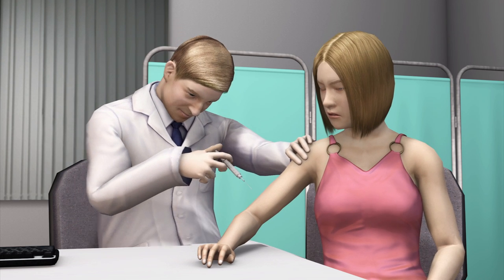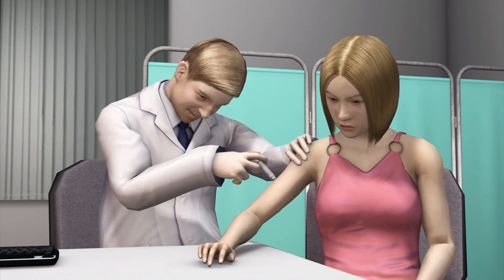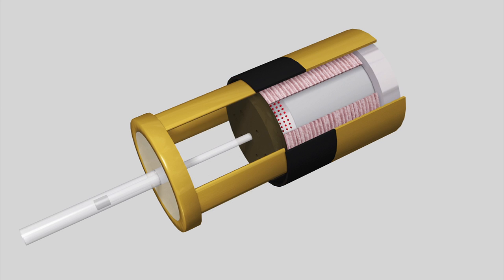Getting a vaccination may soon become a lot less painful. Scientists at MIT have designed a needleless syringe.